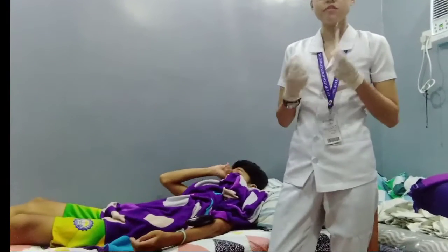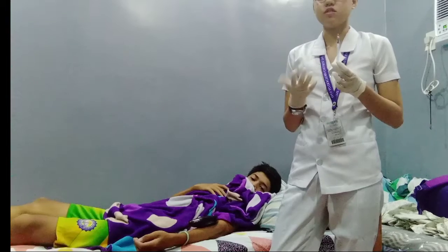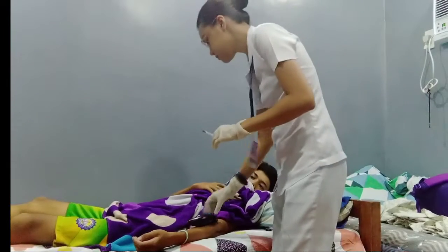Afterwards, we need to stretch the skin taut at the injection site by pulling gently with the thumb and forefinger of your non-dominant hand. This is to avoid pain and to help the needle go in smoothly, and it pulls tissue away from the muscle, making injection easier. Okay.